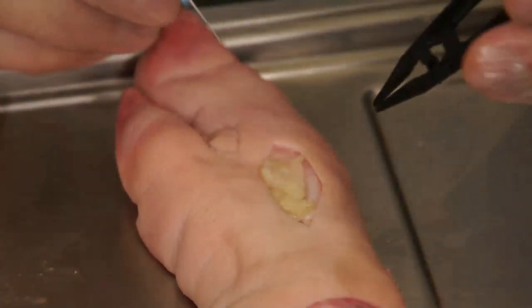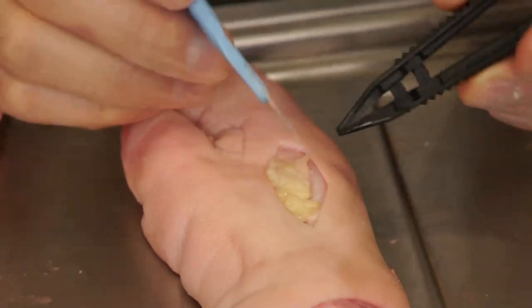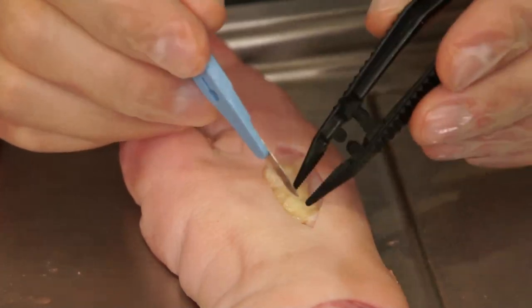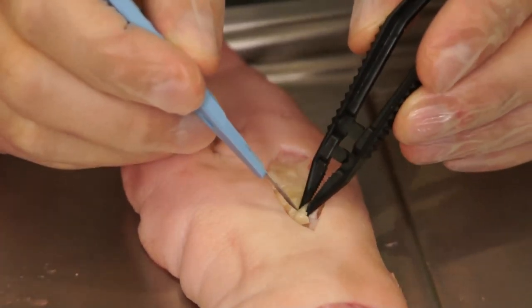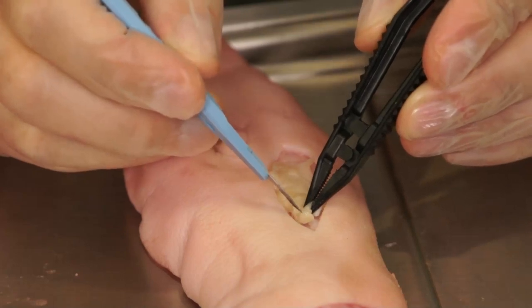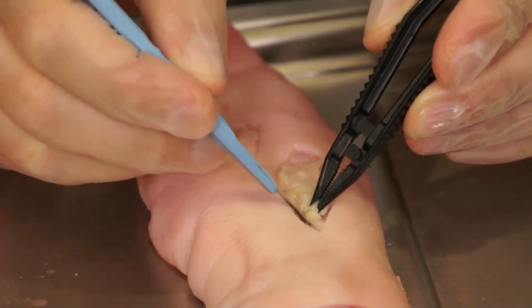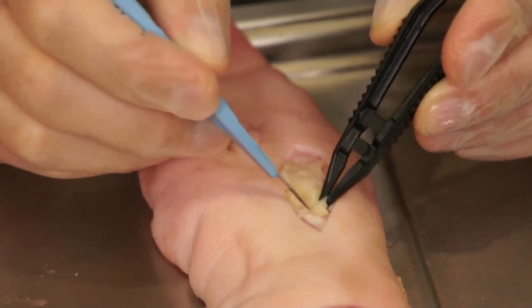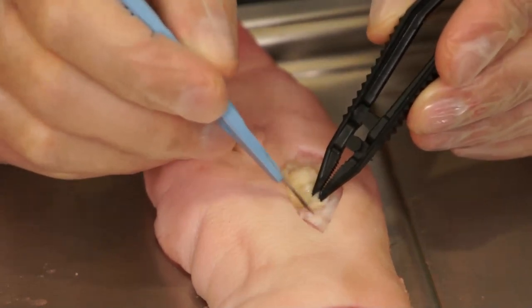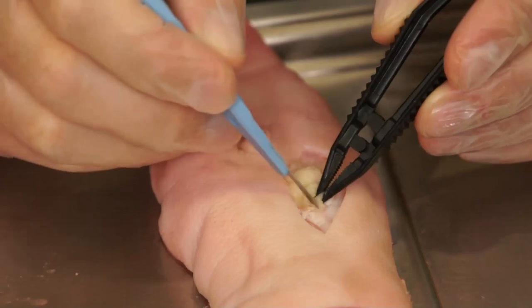Alternatively, a 15 blade scalpel and forceps can be used to perform debridement of yellow necrosis. Commonly this is achieved for a larger wound or a wound that has more adherent yellow necrosis than might be easily removed with a dermal curette.